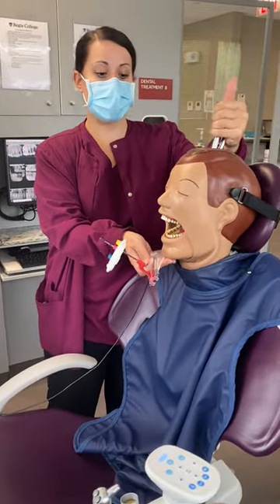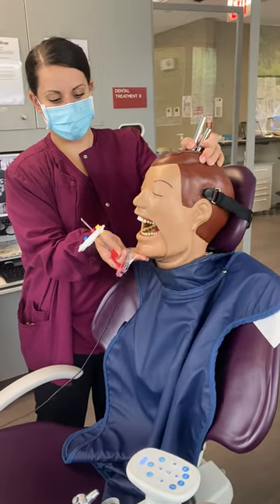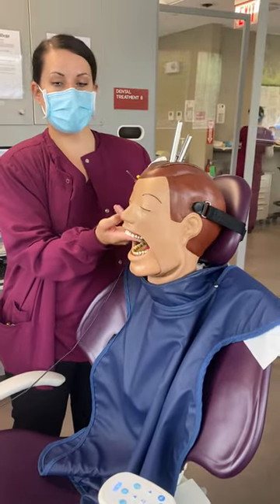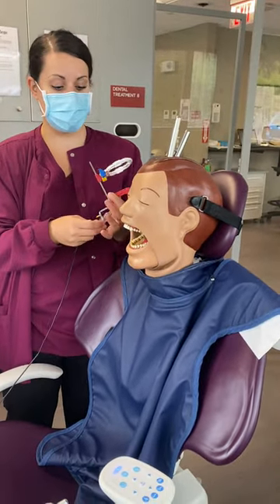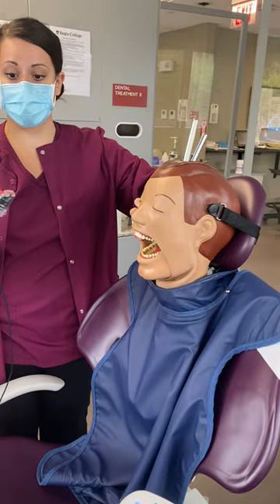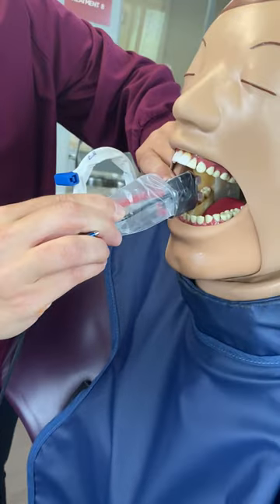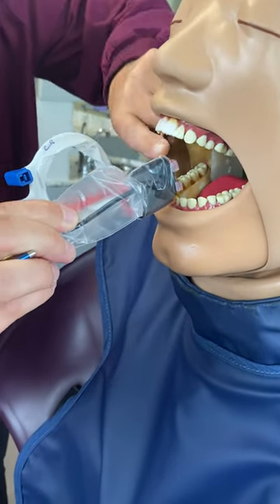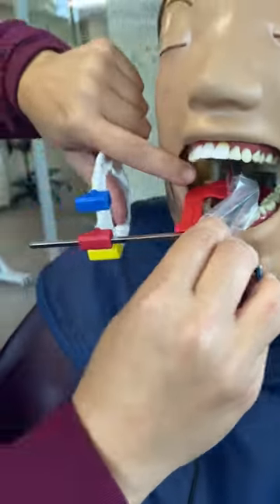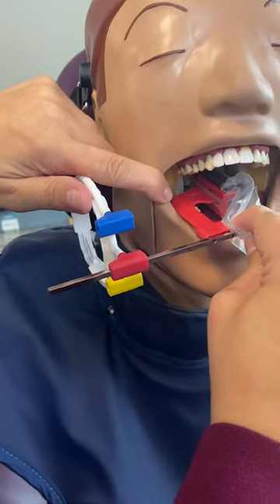This silver handle is how we close and open Dexter's mouth — be careful, he's a little fragile. You want to make sure that the maxilla is parallel to the floor; that's going to help with our angulation. For our first shot, we're going to do our molar shot. You want to make sure that you follow the central ray and key into proximal space. Our central ray for our molar shot is right in the mandibular molar, right down in the middle.